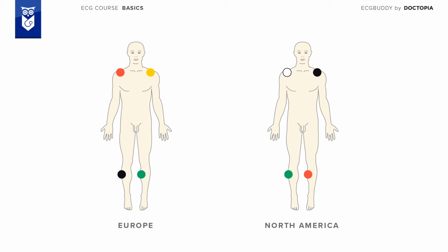Assuming that the electrode on the left leg is exactly caudal to the heart, lead 2 points diagonally down to the left and lead 3 points diagonally down to the right. These 3 limb leads form the points of the so-called Einthoven triangle. The Goldberger AV lead system uses the same 3 electrodes as the Einthoven system.